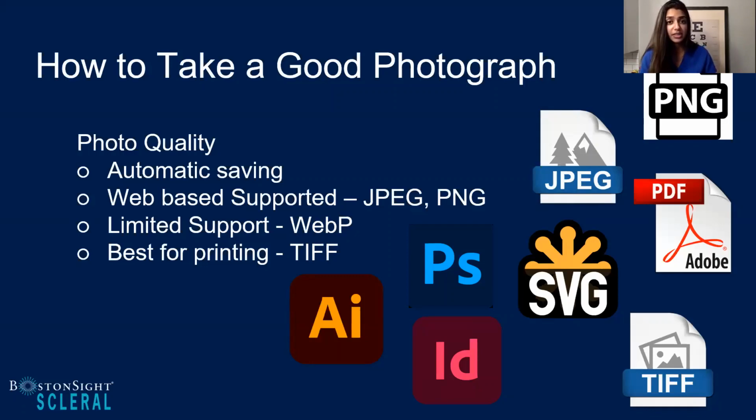Also, we know that Adobe PDFs or JPEG images, for example, are the most universal across various systems, but I think it doesn't necessarily give you the detail that you're looking for compared to PNG files. But unfortunately, PNG files are massive in size. So really assess what your storage device is going to be, whether it's your EMR or an external hard drive, so you can keep these images and hang on to them for future reference.